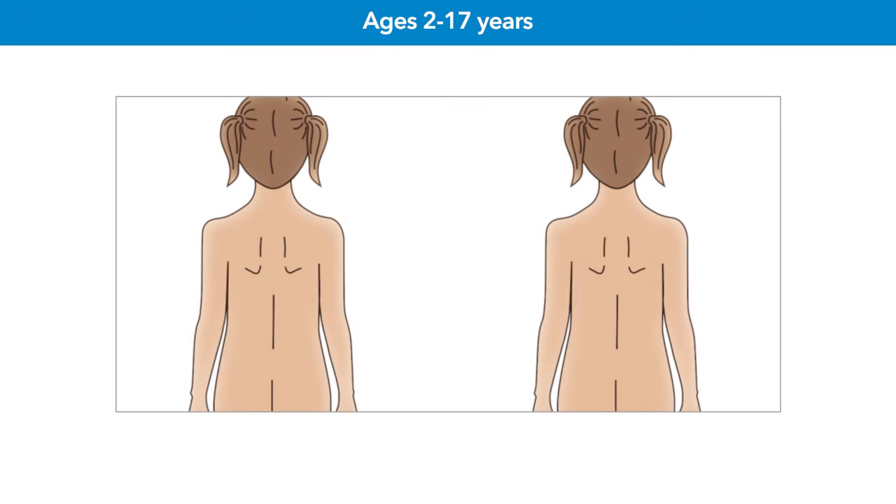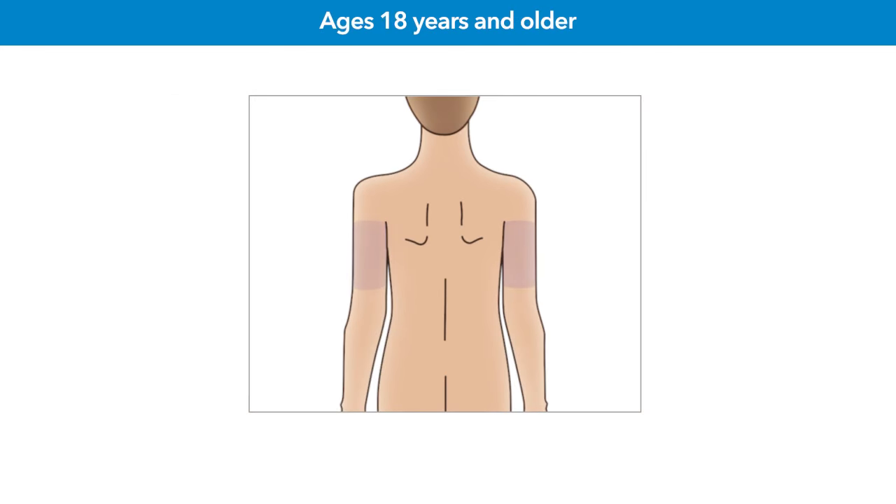Next, you'll need to choose a site to insert the sensor. Target the shaded areas — you'll want to choose an insertion site that has adequate fat. Choose the shaded areas approved for your age group: back of upper arm or upper buttock for ages 2 to 17 years. If you use the upper buttock, target the top third of the buttocks area. Back of upper arm for 18 years and older. You may need help from another person to insert the sensor into the back of the upper arm or the upper buttock.